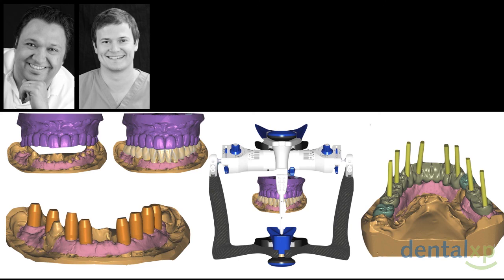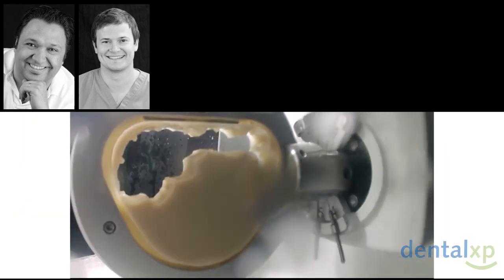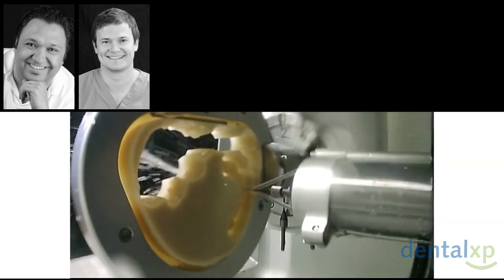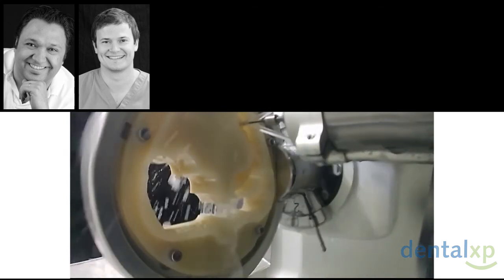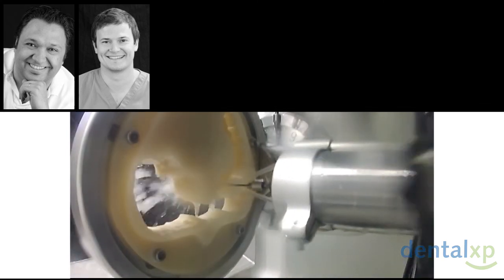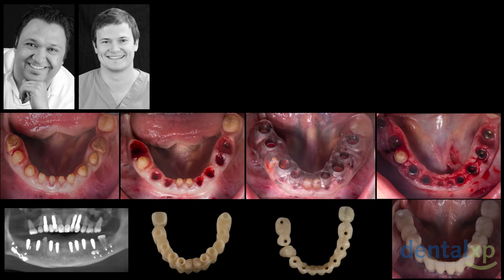And what is cool here is that we are able to use the template that has been produced in the lab design to superimpose it in the software that will be able to do the provisional. We can put it on the model. You can see that the surgical planning was correct because the implant positions are really the same as what we planned. And then we just have to click on one button in the lab and mill the restoration. You can mill the provisional that will be screw retained, but we can also mill the two provisional crowns that will be put on the permanent teeth.